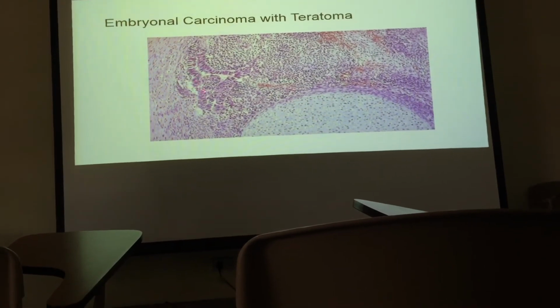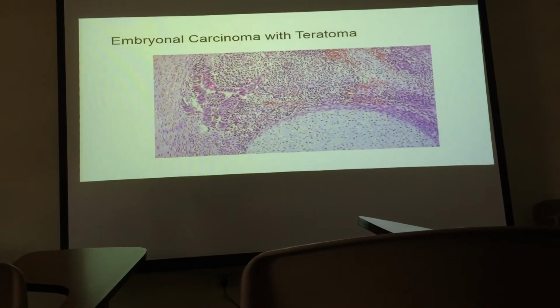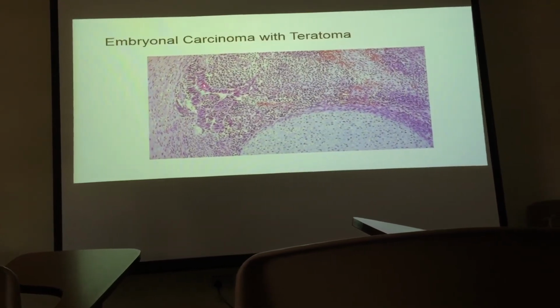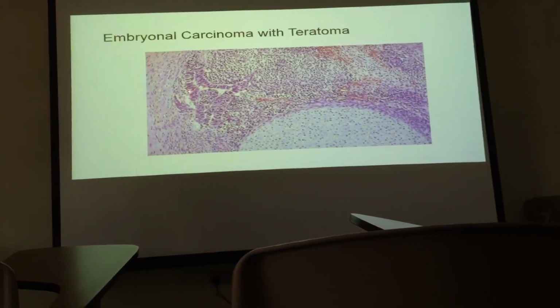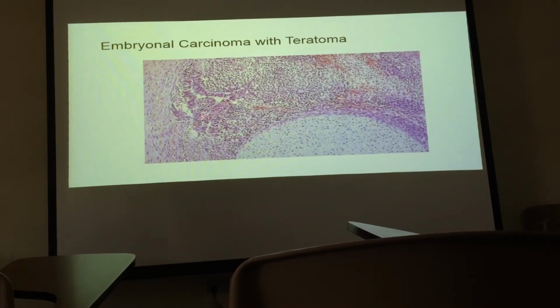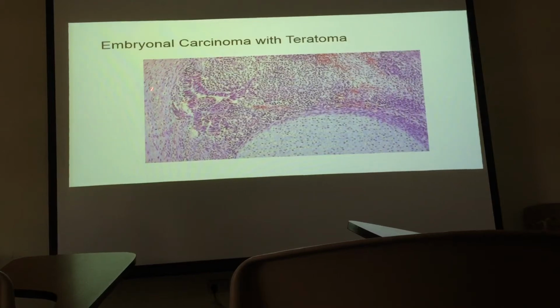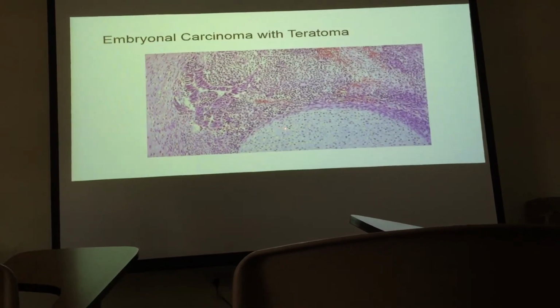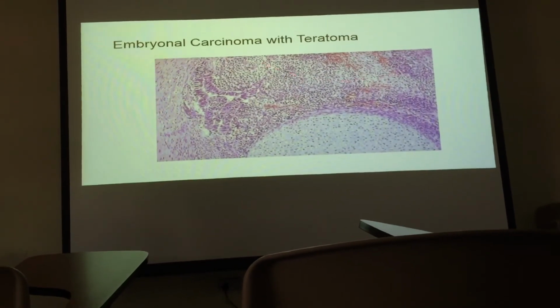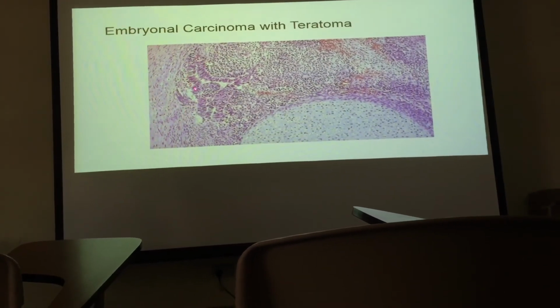No, this. Yes, glandular structure. Very good. Epithelial cells, glandular structure, and these epithelial cells do not have normal nuclei. You can see the multi-layering of nuclei, and this is basically a low power image. This is the embryonal carcinoma component. This is the neural tissue, mature neural tissue, cartilage, stromal tissue, and this is the embryonal carcinoma component.